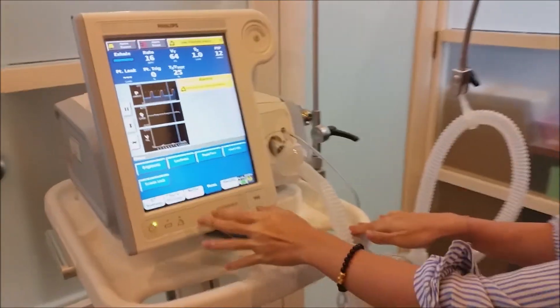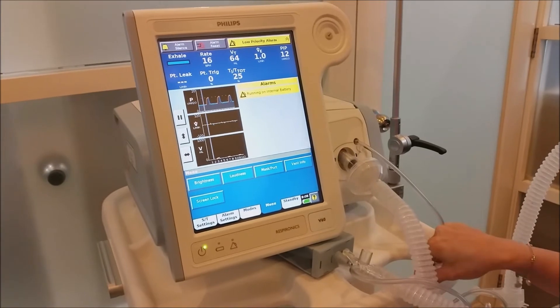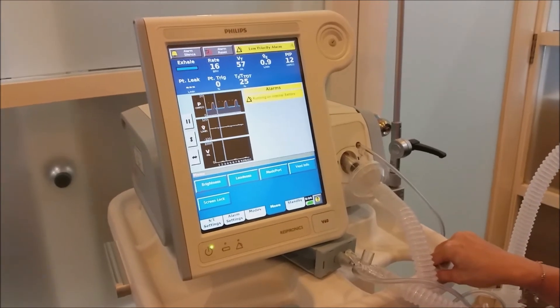That's about it for the pre-setup part. This machine has four modes, which are ST, CPAP, PCV, and AVAPS.